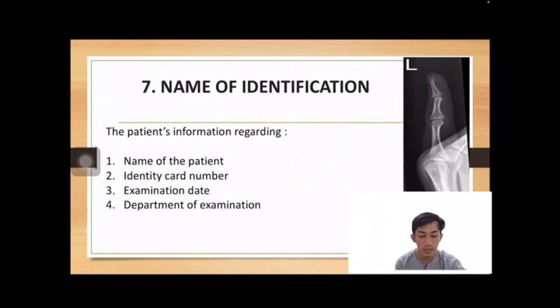And fourth is the department of examination. We can see right now there is no patient information on this projection, so this radiograph cannot be used for examinations.